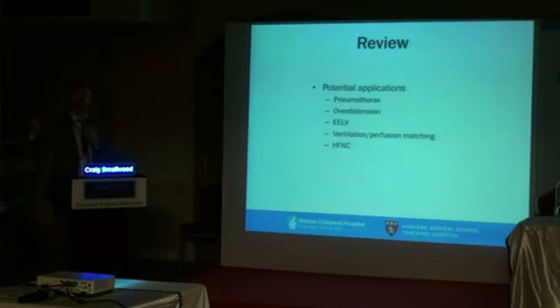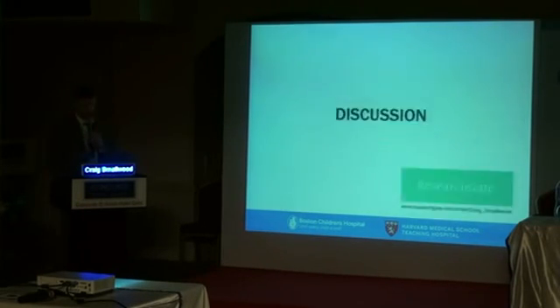So, potential applications. I gave you a survey, probably a biased survey. I have my own interests, obviously, with the resolution of atelectasis. But pneumothorax is an interesting application, as are overdistension, balancing overdistension and collapse, end expiratory lung volume, and ventilation perfusion matching. And with high flow nasal cannula, the last application, it's not necessarily that you'll always need EIT to apply high flow, but EIT can be a tremendous research tool as we learn how to optimize these therapies that are emerging in our NICUs and PICUs. And that was my laboratory and clinical experience. And with that, thank you very much.